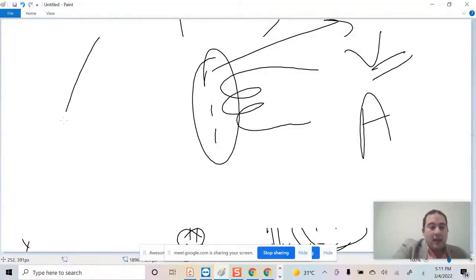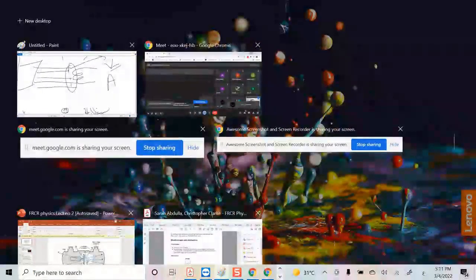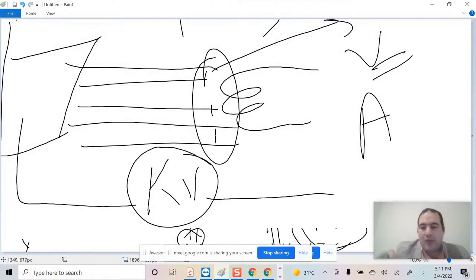Now, on the other side, we have my anode. For the electrons to move from the cathode to the anode, they need another voltage difference, or I have another kilovolt. This is the significant voltage difference that exists on the parameters I have in the machines, and this is what I work on. This provides the electrons to move from the cathode to the anode. I have the kilovolt, which is either 120, 80, 70, or any type of setting that I use directly for the model I am working on.